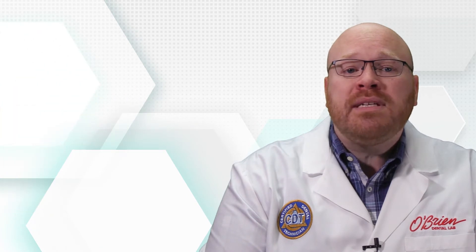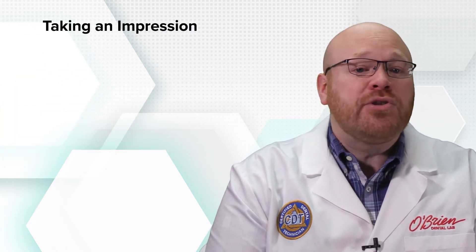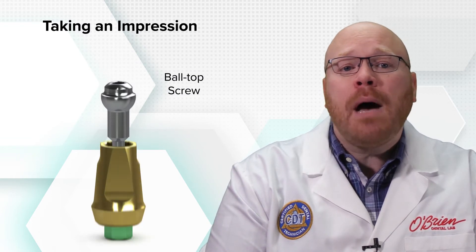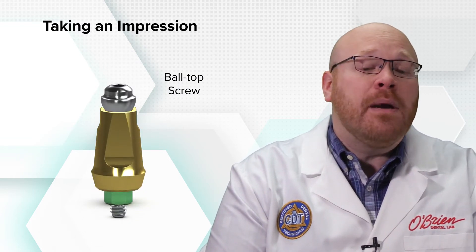To use the 3-in-1 abutment to take an impression, there is a separate screw that needs to be used. It's called the ball top screw, and when used, the ball top extends out of the coronal end of the abutment.